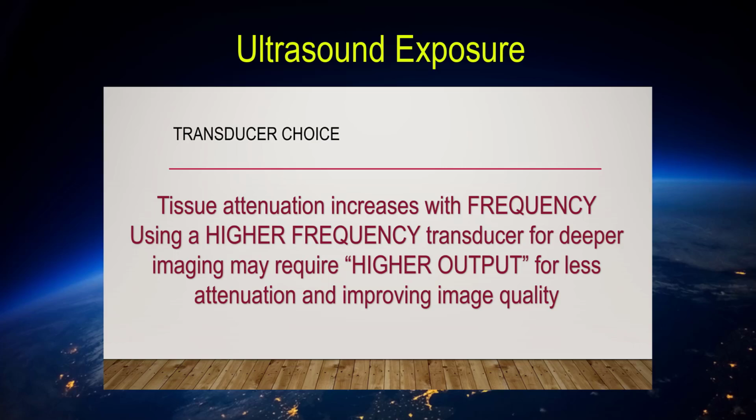This was a very important concept, demonstrating that the use of our daily controls that we use during clinical ultrasonography can make a significant difference in tissue exposure to ultrasound, increases patient safety, and leads to a more rational application of the ALARA principle.